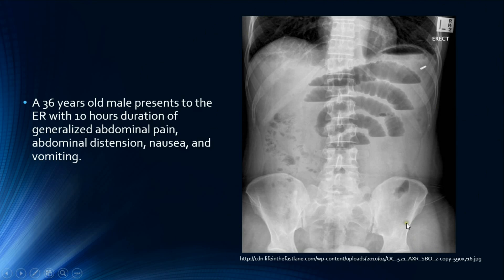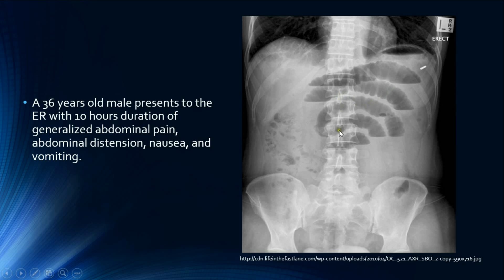This is an erect abdominal radiograph in the AP projection, which is the standard projection for abdominal radiographs. I do not see any patient details, so I would like to confirm this is the correct patient with the hospital number, date, and time mentioned. Regarding technical quality, we can see both hemidiaphragms, but I cannot see the pubic symphysis nor the hernial orifices — therefore this is a technically inadequate radiograph. However, the penetration is adequate because we can see the spinous processes through the vertebral bodies.